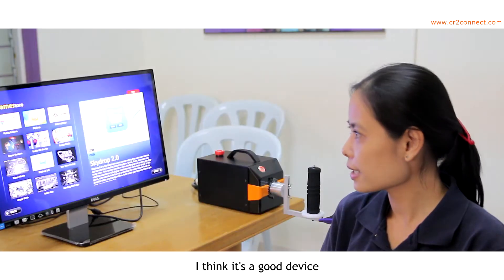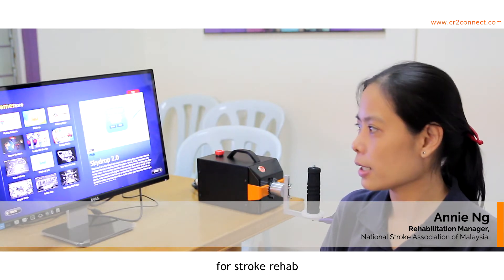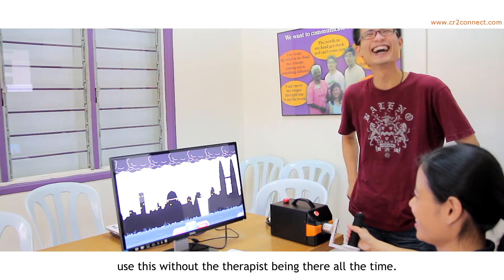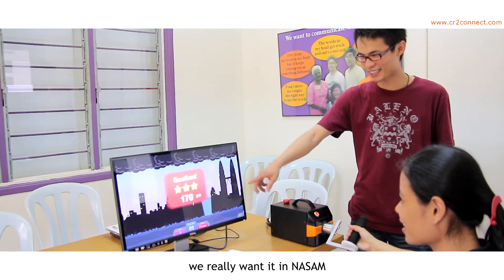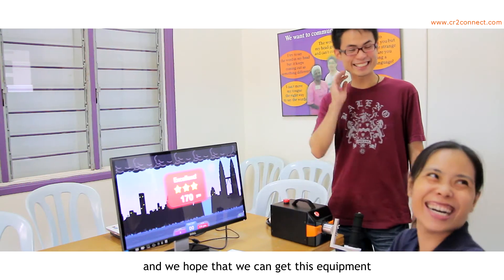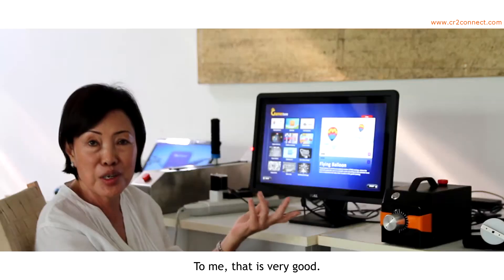I think it's a good device for stroke rehab because patients are able to use this without the therapist being there all the time. We really want it in NASAM and we hope that we can get this equipment, because so far we don't have any robotic equipment of this type in NASAM.